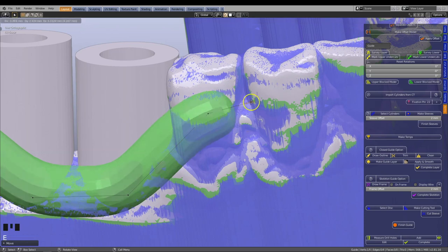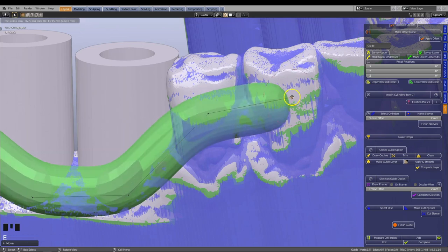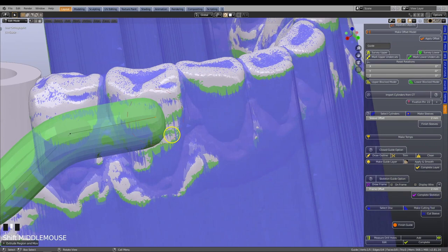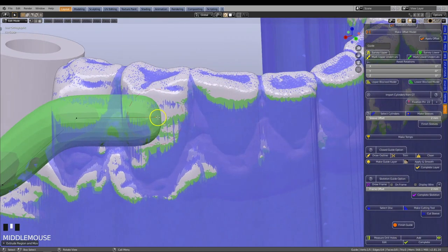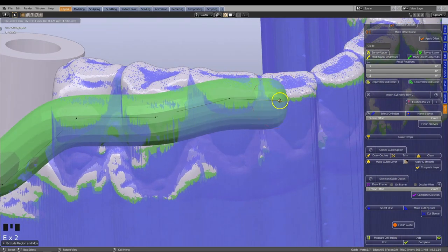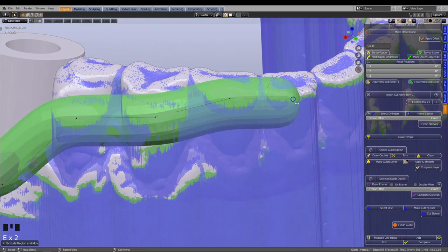Press E to extrude the line. Place one vertex on each tooth. Continue this way, try and follow the survey line.